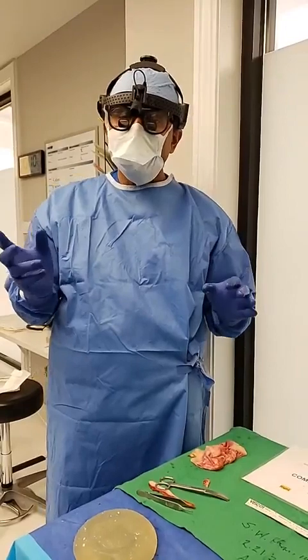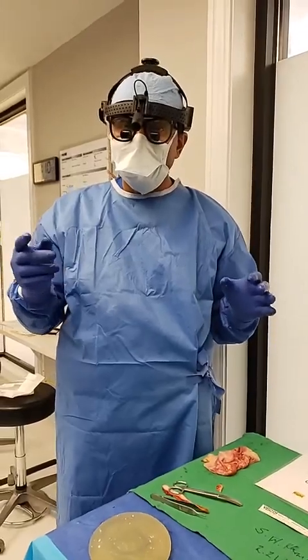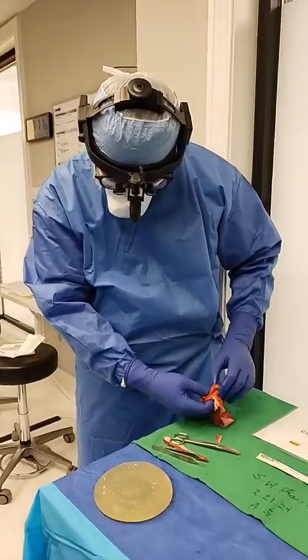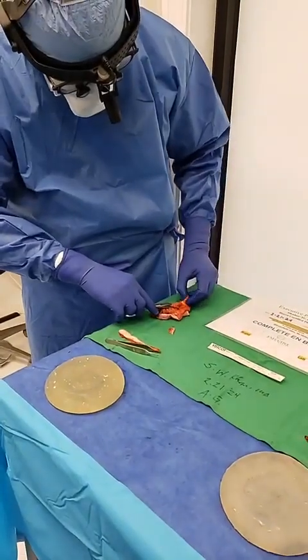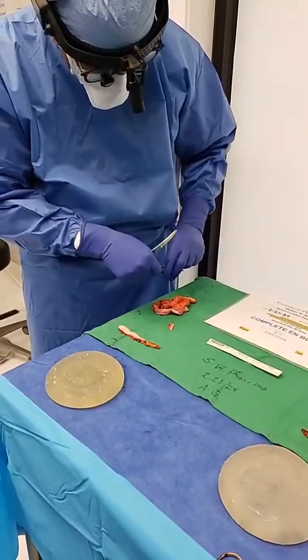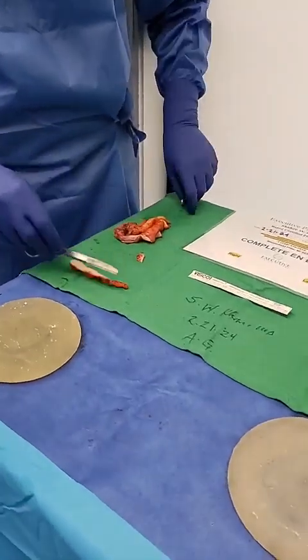Ten years, 20 years from now, she does not have to worry about any residual capsules, because any inflamed tissue, even this tissue that you see right around, has been removed completely, definitively, so there is no inflammatory burden left behind. And as you will see right here, this tissue is not healthy. And as I use my pickup, I just want to dissect this open in case I find something. So nothing over here. All of this tissue is inflamed.